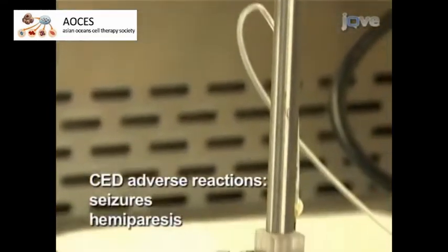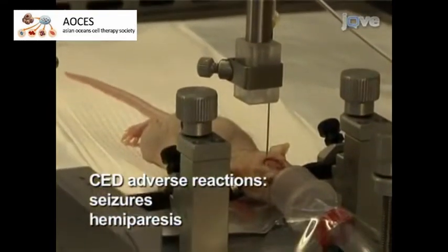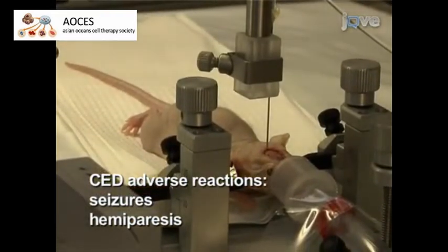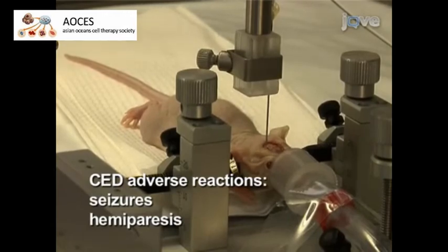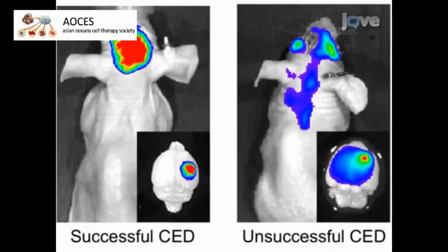For CED, neurologic function is important for assessing successful administration of therapy. A mouse that is exhibiting seizures or hemiparesis may have received improper infusion. Here, in vivo imaging was performed on a mouse with a successful CED infusion, shown on the left, and an unsuccessful infusion, shown on the right. Note that in the successful infusion, the imaging signal is localized to the brain, while in the unsuccessful infusion, the signal has spread down the neuroaxis.